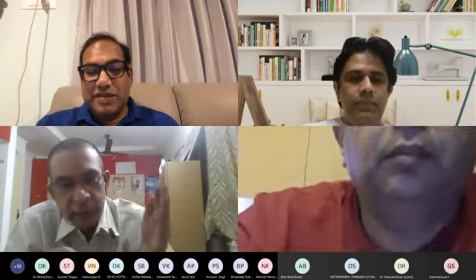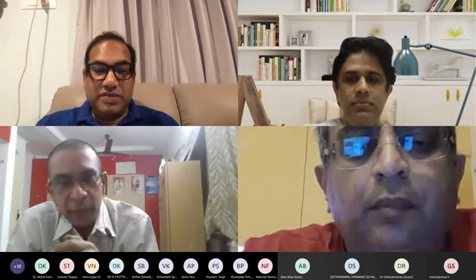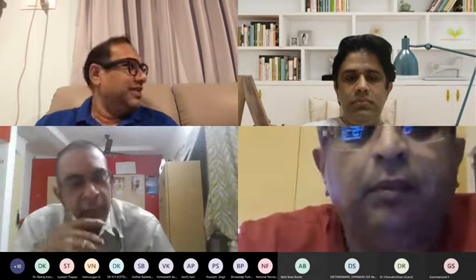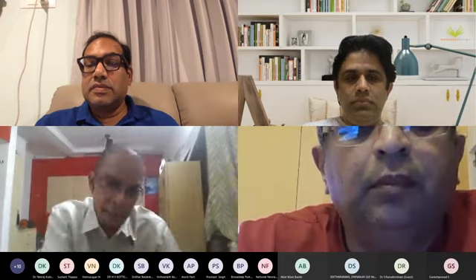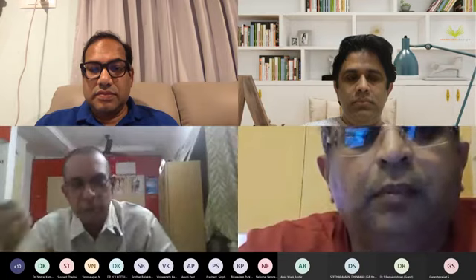Yeah, as you very clearly said, low acuity, mid acuity, and very high acuity. So we have various ranges. It's a big bouquet of flowers with different flowers. You pick and choose different monitors. The accessory compatibility between the ranges is very critical, and that is going to make or break it. Because if you really need to maintain 3 different inventories for low, mid, and high, then it becomes a very cumbersome process. So accessory compatibility, central station alignment, whether that full range can get into a single central station, the ease of use, the user interface, whether it is the same user interface for low, mid, and high, so the staff nurses do not need much training. Those are fundamental things which we need to really see.